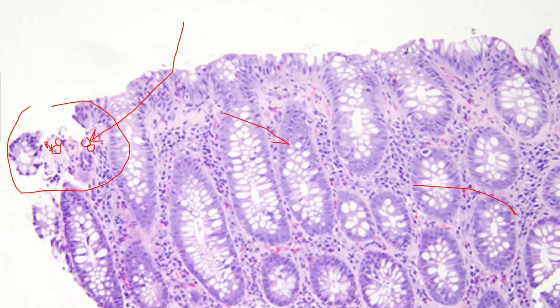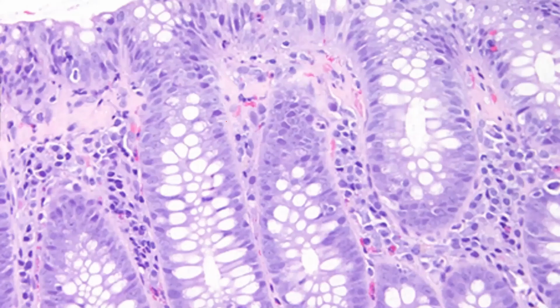But I agree with most of you, we will find an example like this a nightmare. This is difficult. We need to see more. We need to have the history to build up a case like this. And yes, if you count the lymphocytes on the surface epithelium, remember, we don't count in the crypt epithelium because naturally it is increased. But if you count it on the surface epithelium, you will definitely be able to reach this diagnosis.